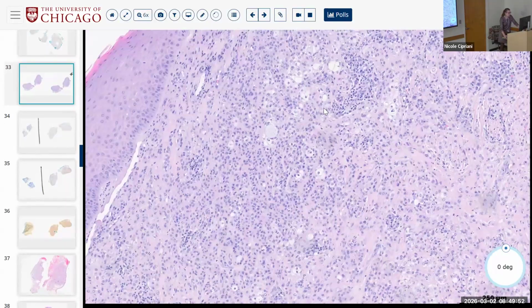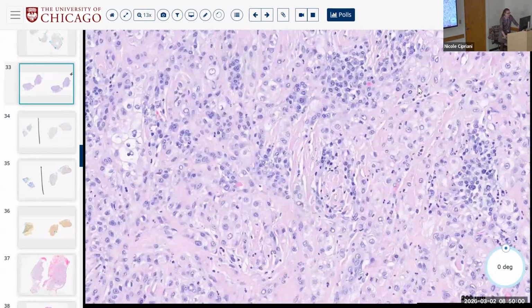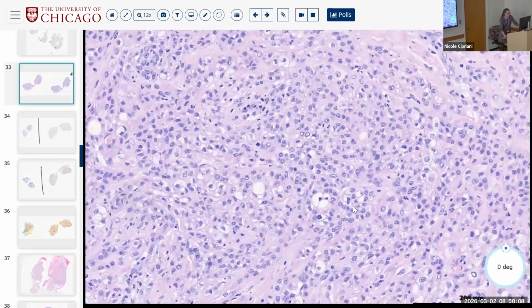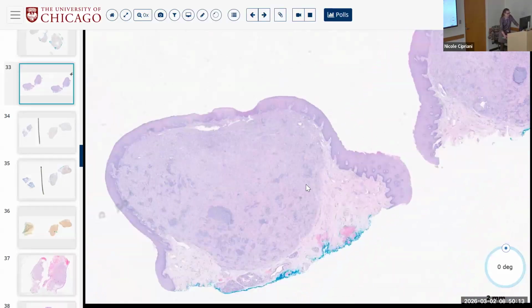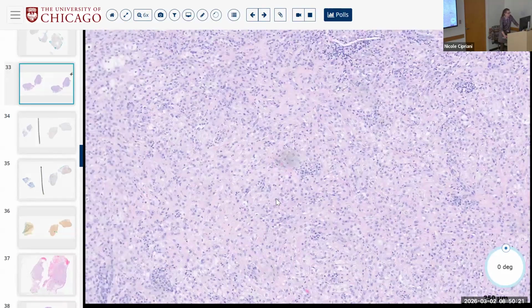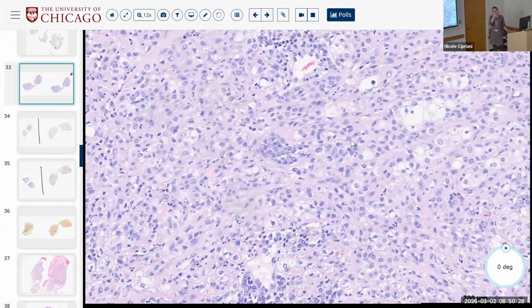A lot of glycogenated, question mark, mucinous clear cells, right? Admixed inflammation. You see any good structures? Or is this mostly sheet-like? Mostly sheet. Okay. Anybody want to throw out a differential, or do you just want to see what the stains show?